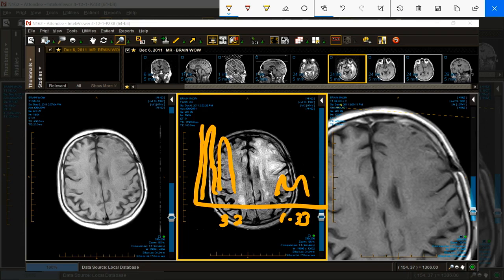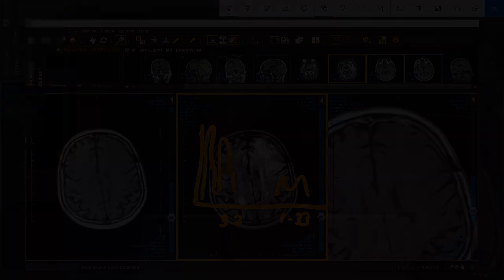And taurine actually has two triplet peaks. I'm not going to draw them. This is an inhibitory neurotransmitter that activates GABA A receptors. Some people actually use it as a neuromodulator for certain diseases. People actually take oral taurine as a supplement, and it can be very effective for certain diseases. Unfortunately, it is elevated in medulloblastoma, PNET, microadenoma, and metastatic renal cell carcinoma. Where it's useful, medulloblastoma and PNET, to differentiate it from meningioma when it's peripheral or ependymoma.